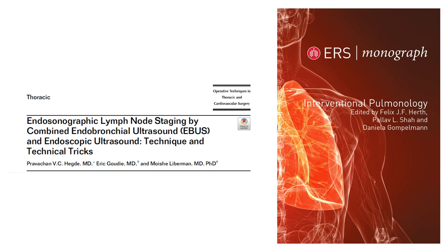But anecdotally, I'll tell you that when I have a case of lymphoma, we do cryobiopsies from the transbronchial side, and we do with a conventional EUS scope, we use the EUS FNB needle, 22 gauge, and I have found no difference in the yield when both structures can be accessed via EBUS and EUS.